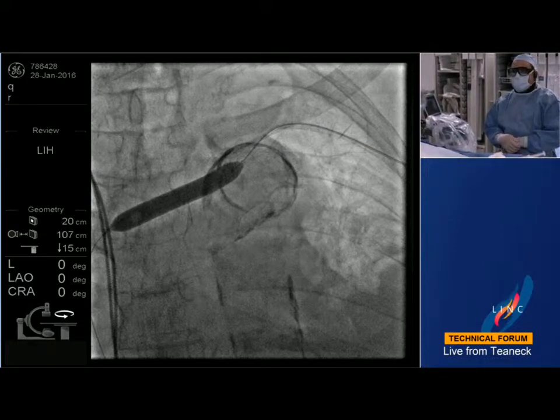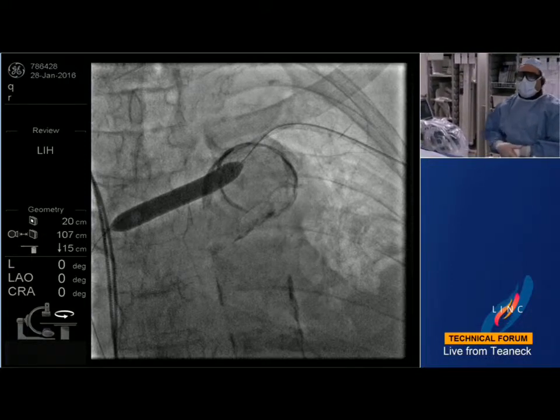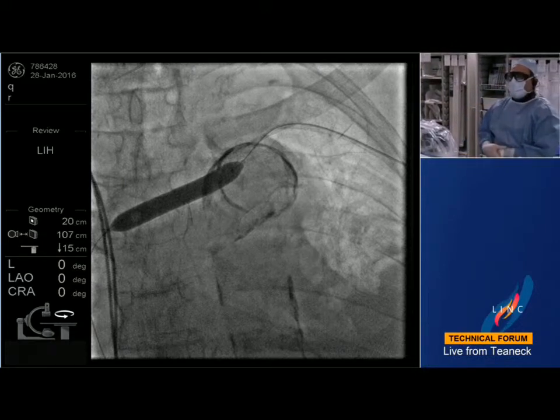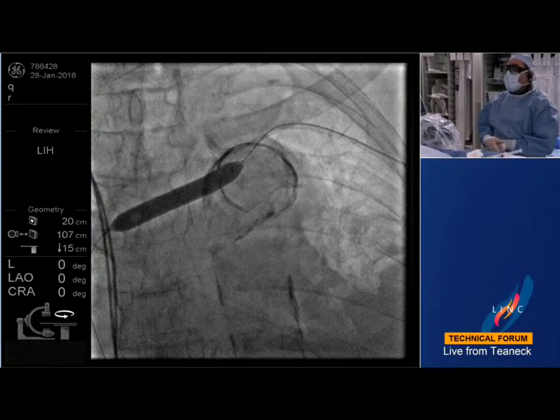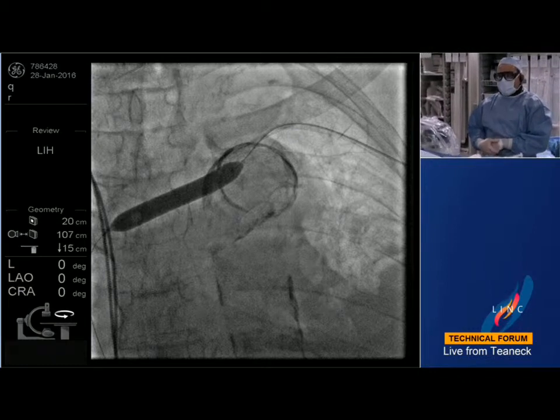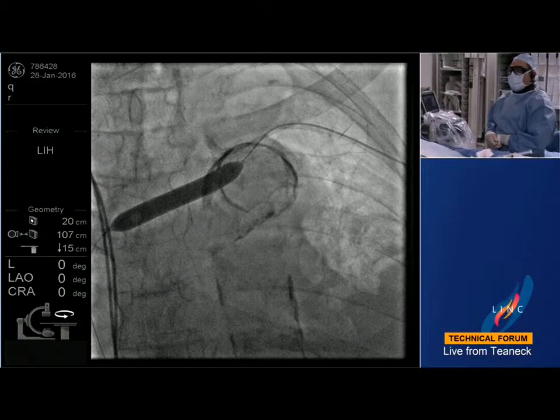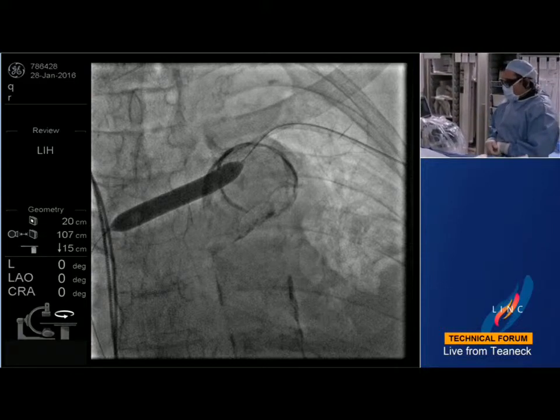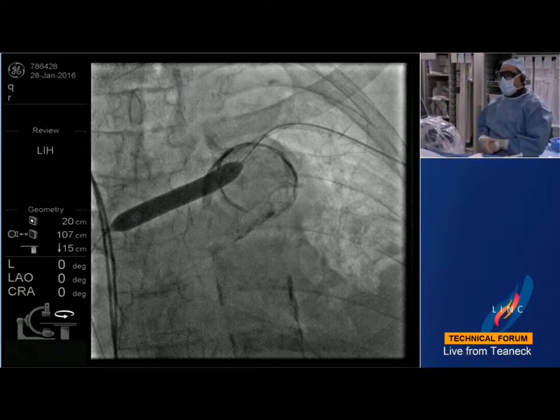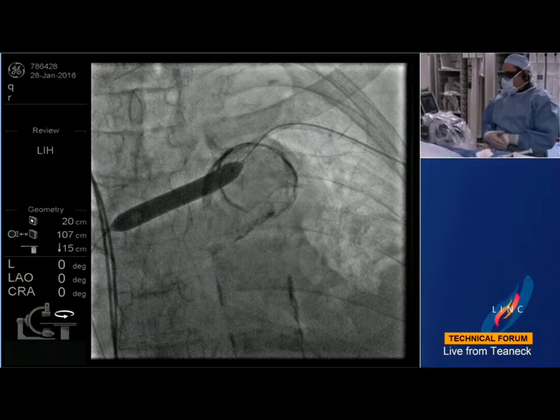And how many prior interventions has this gentleman had on his fistula? Has this been an ongoing recurrent stenosis? This has been ongoing. He's on our maintenance. Yes, this has been a recurrent stenosis, and like I said, this is the first time I went back. We have the 3 of us here, so we each take turns doing our hemodialysis access, and all of the interventions previously have been in that forearm, cephalic outflow in the pseudoaneurysm region, before and after them.